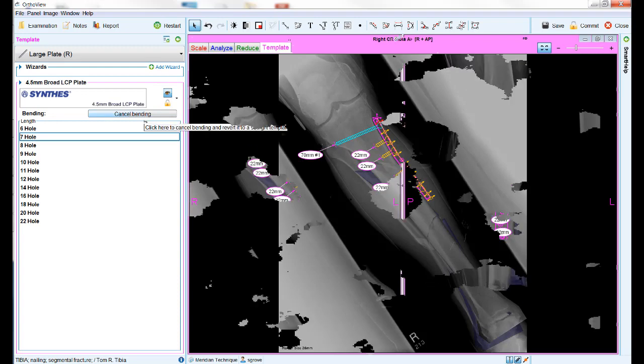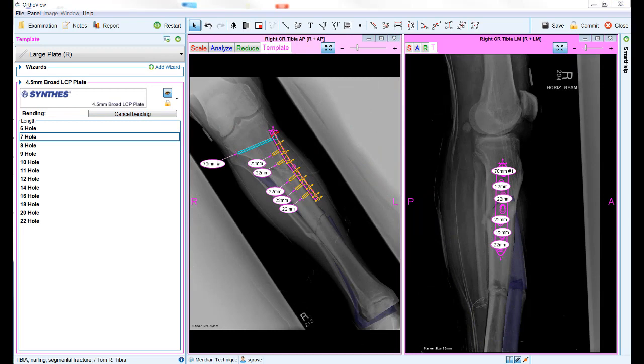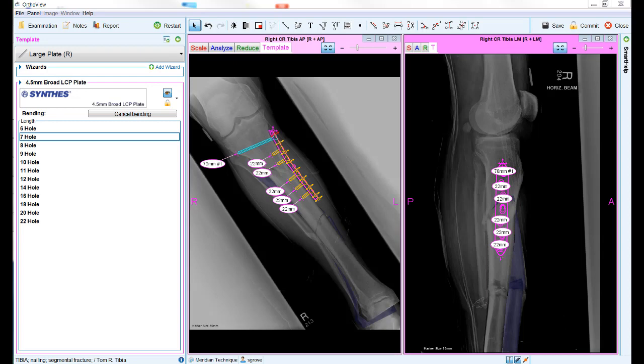To complete the planning session, everything we have done so far can be replicated on the lateral view. It is important to note that whilst all the template sizes and options will automatically be applied to both views, the position of the templates is not automatically matched, and each template must be manually placed in the required position in each view.